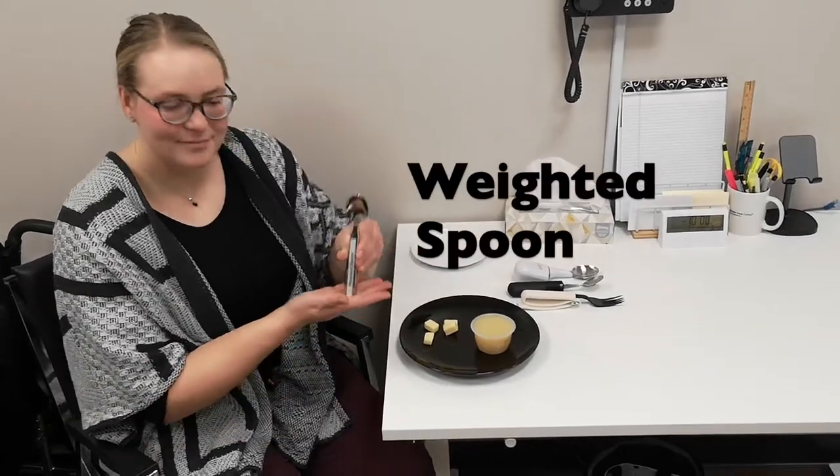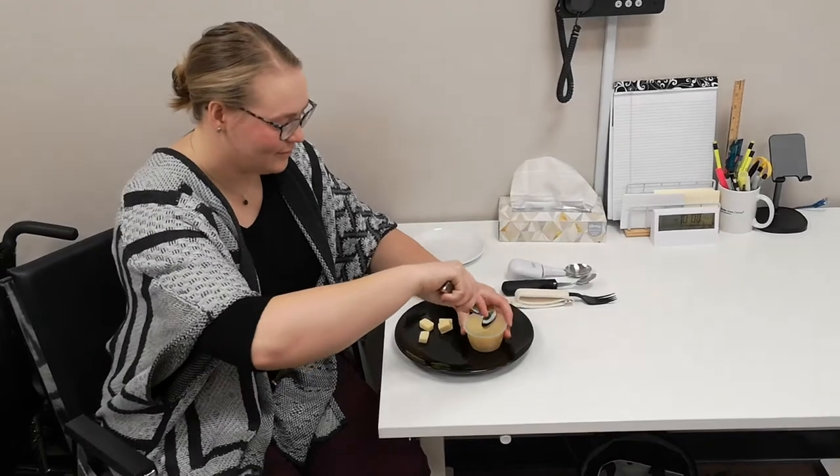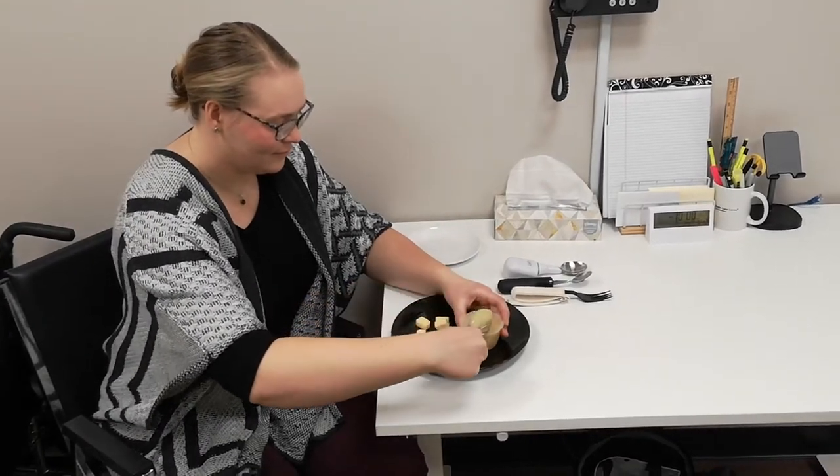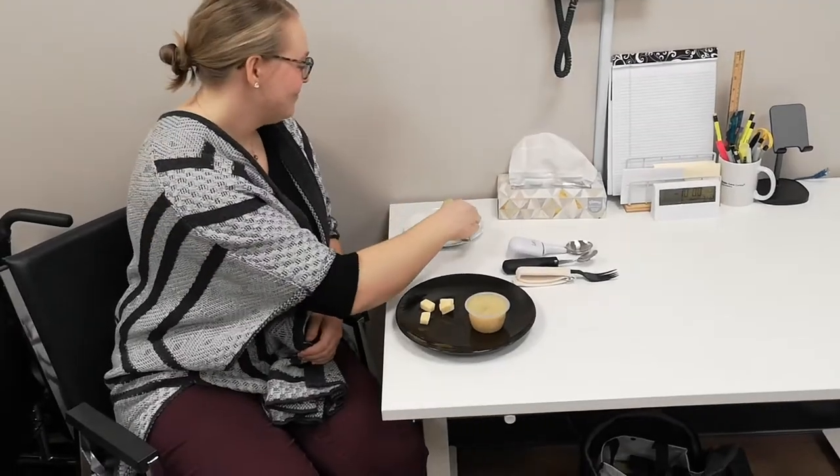Weighted cutlery can be helpful for individuals with tremor. However, it is important to note that not everyone benefits from this type of assistive device. It is a good idea to try before you buy for this item.